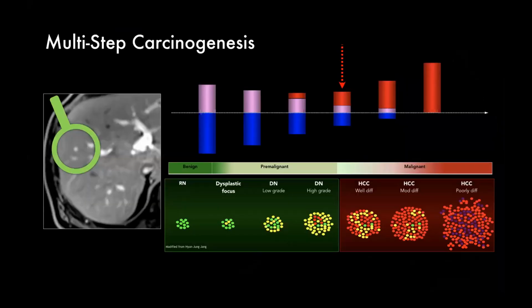Please do remember that the development of HCC is not a single time point; we are assessing these observations over a period of years. Ideally speaking, when you have an at-risk liver, which is now migrating from a normal liver, for example, a normal liver has a dominant portal venous supply. So suppose you've got chronic active hepatitis moving towards F1 fibrosis, F2, F3, F4. At that level of cirrhosis, there is going to be development of regenerative nodules, micro or macro regenerative nodules. Ideally speaking, the parent liver and the regenerative nodules tend to have identical vascular supply.